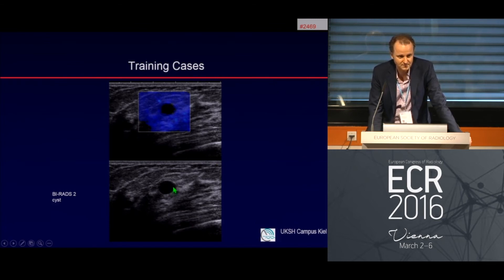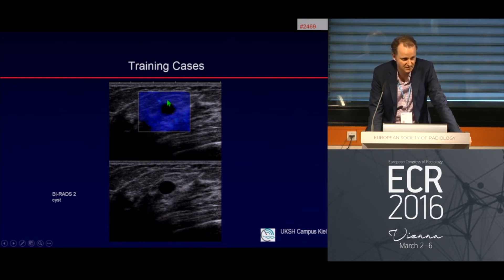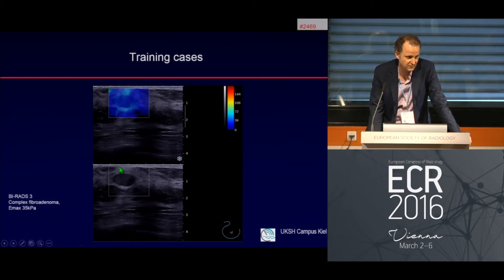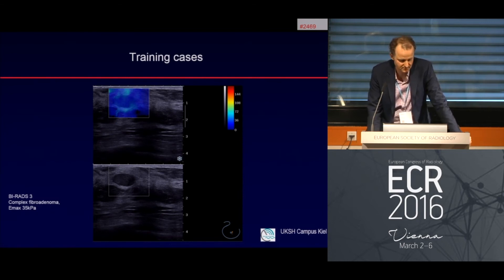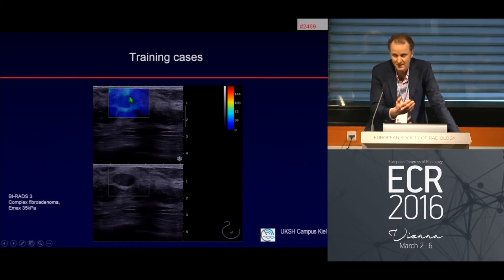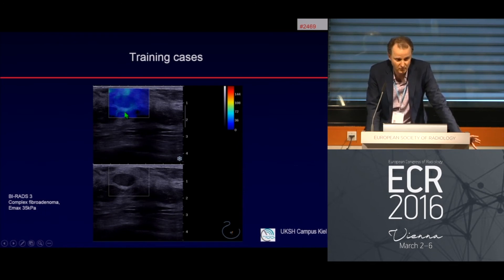Case 1: Who votes benign, who votes malignant? This is a classic benign finding — an anechoic lesion with a white area in the center, classic for a cyst. Case 2: An oval, well-defined but solid lesion. Elastography shows a blue signal with some vertical cords — a very soft lesion at 35 kilopascal maximum — indicating a benign finding. This is a complex fibroadenoma, and elastography helps prevent the patient from undergoing biopsy.